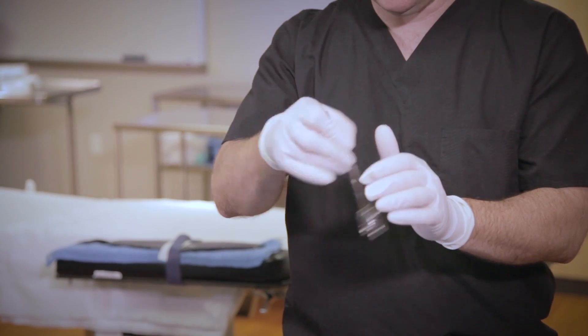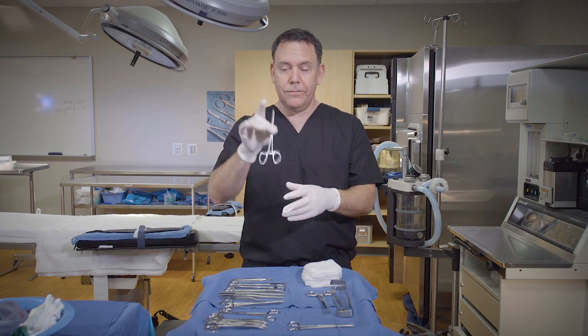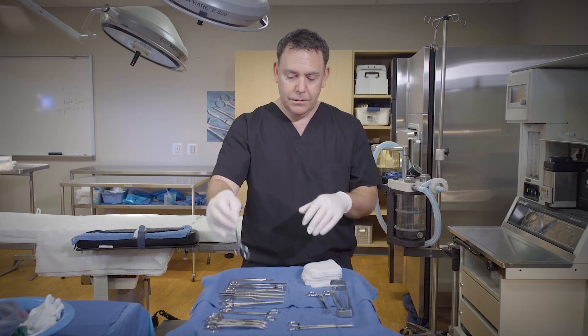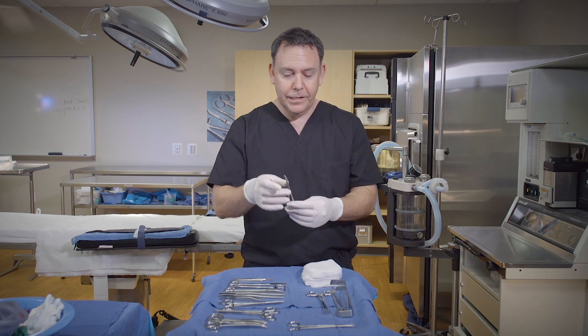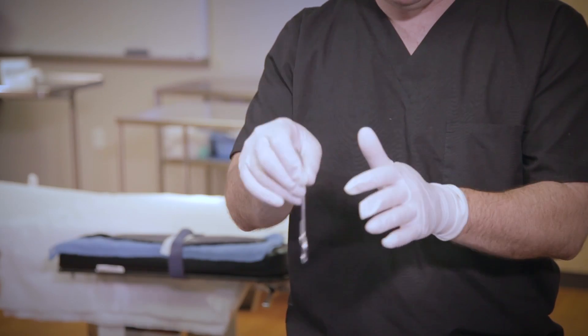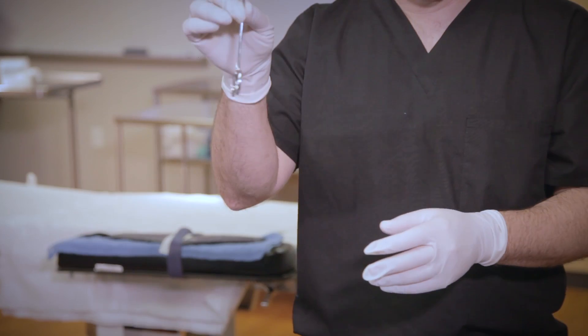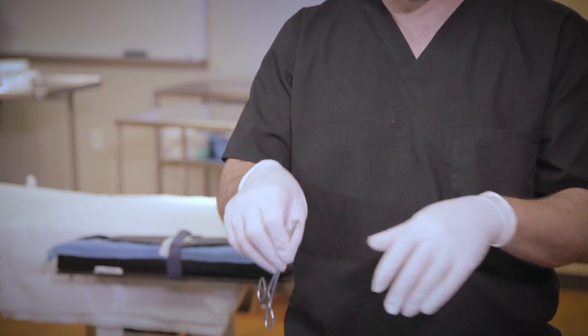You hear that nice little click? Next, the Coker — middle finger on the box lock, straight up and down, pass firmly. Alice forceps — middle finger on the box lock, pass firmly. Kelly — middle finger on the box lock, straight up and down, pass firmly. And even a Babcock — middle finger on the box lock, pass firmly.